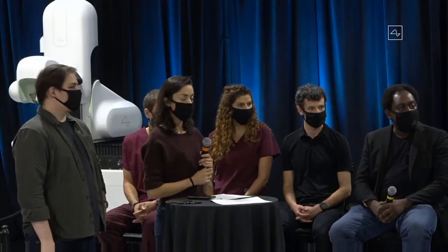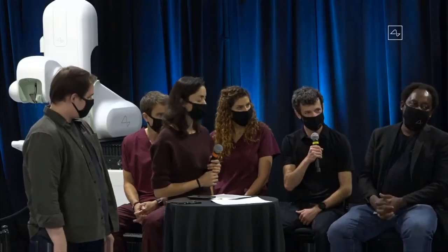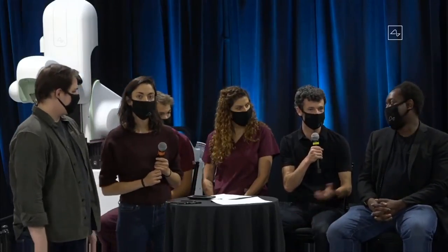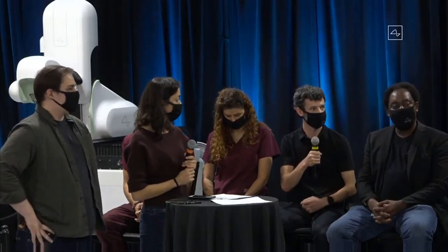Zach, how long are the threads? Well, right now they're about 43 millimeters, but like I said, it's tunable. So if we want to hit deep brain regions or some other brain area, we totally can do that.